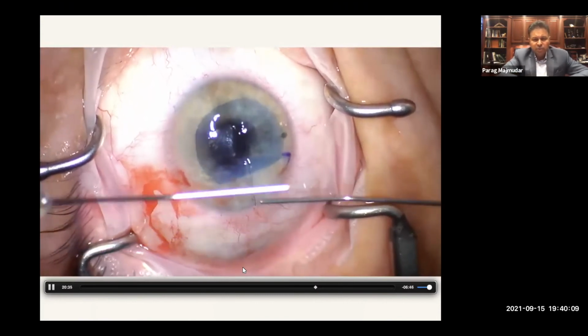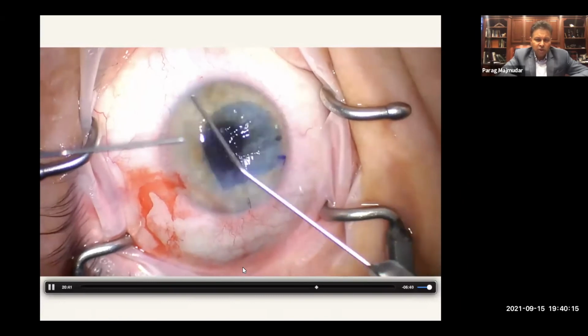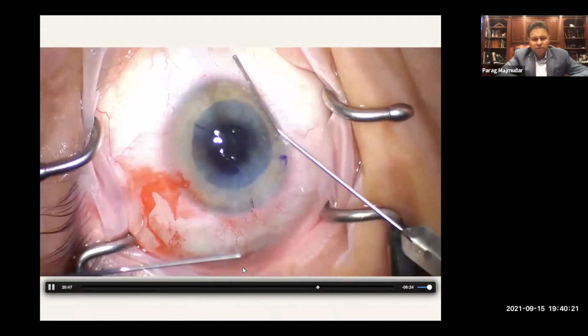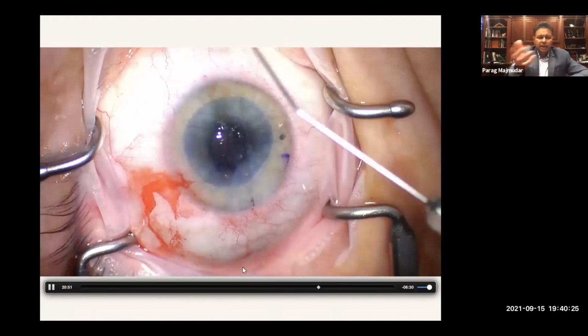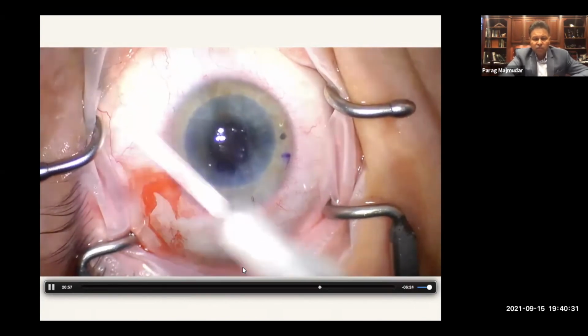And here you can see we're making progress, and all these maneuvers are on the corneal surface. Obviously, nothing's intraocular. And so now here I find that, well, now in all this maneuver, my graft got decentered a little bit. So you can use kind of some tapping maneuvers. Again, all you're using is the fluidics inside the eye, the current of the aqueous to kind of push things where it needs to be. And I'm pretty happy with that configuration there.